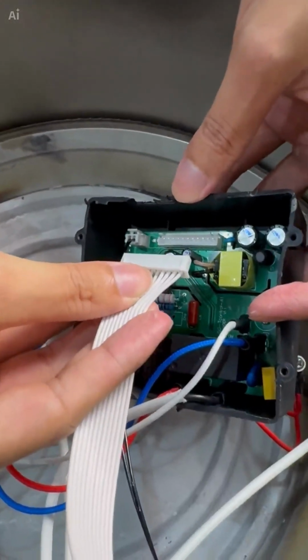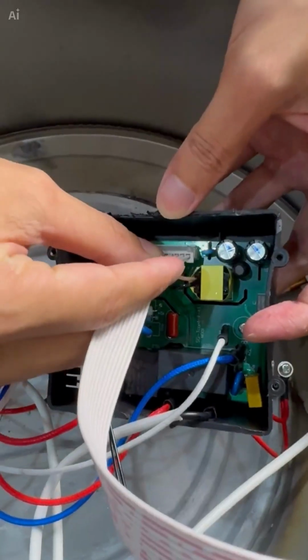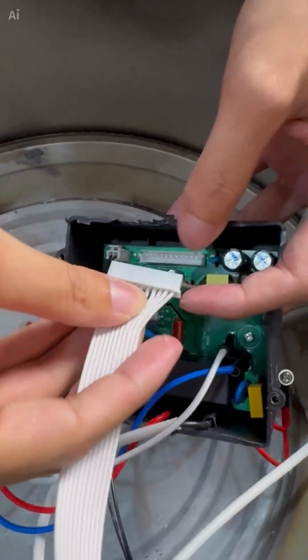Then align the protrusion towards the notch, insert it this way, press firmly on both sides, and the ribbon cable connection will be completed.